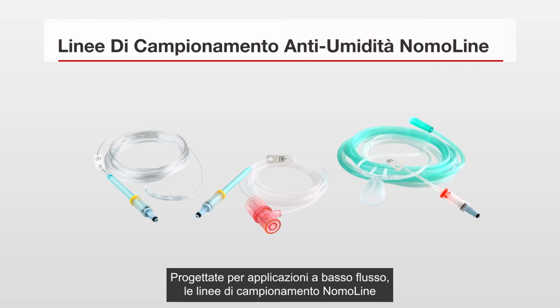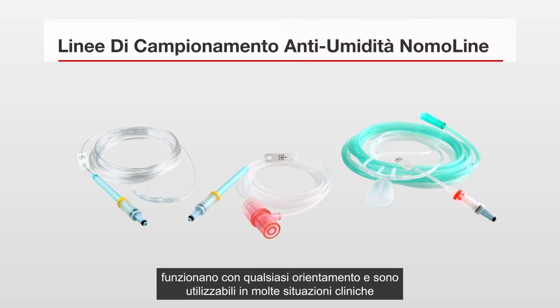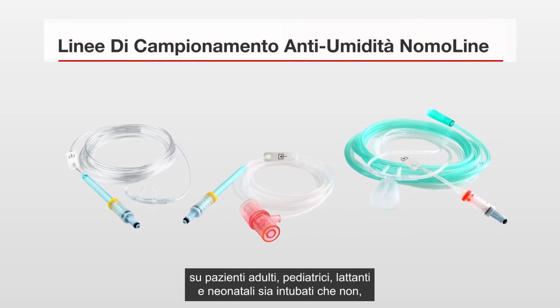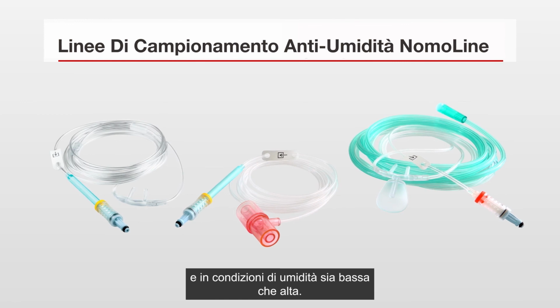Designed for low-flow applications with functionality in any orientation, NomoLine sampling lines can be used in a variety of clinical scenarios on both intubated and non-intubated adult, pediatric, infant, and neonatal patients in both low and high humidity configurations.